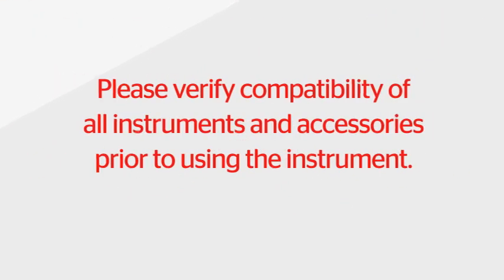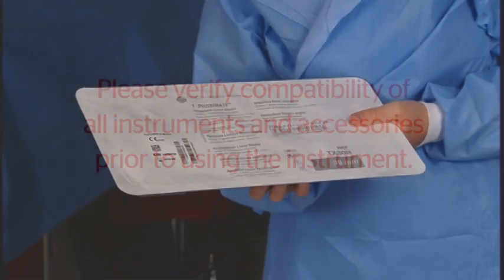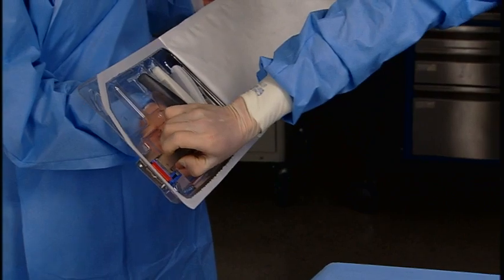Please verify compatibility of all instruments and accessories prior to using the instrument. Using sterile technique, remove the instrument from the package. To avoid damage, don't flip the instrument into the sterile field.